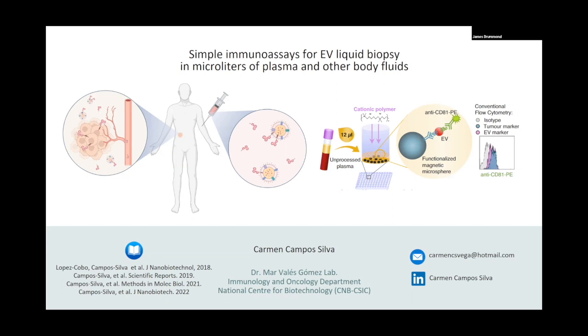I don't know why my video is not working on my screen, but I was just wondering about the polymers you're using. You used all the cationic ones, polylysine, polybrene. Is it necessary to use a charged polymer, or can you get away with other non-charged ones?